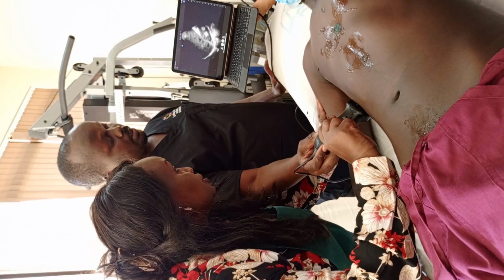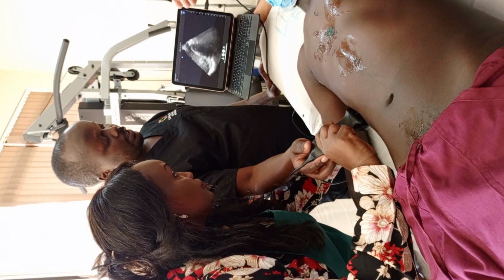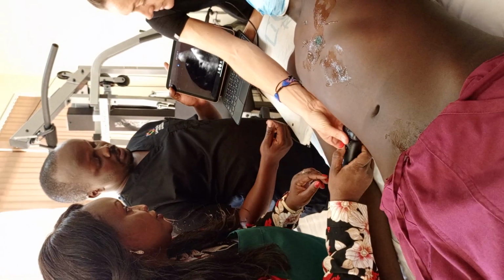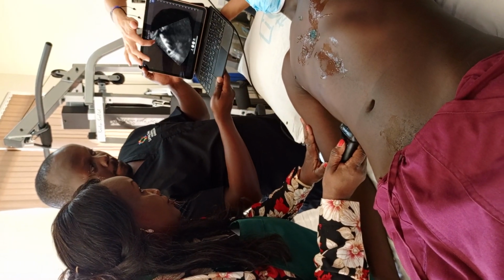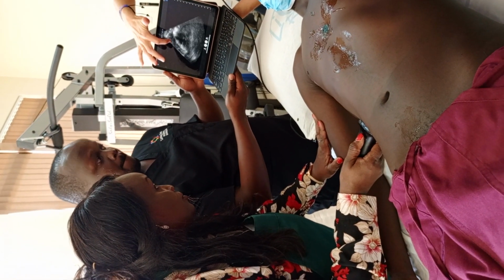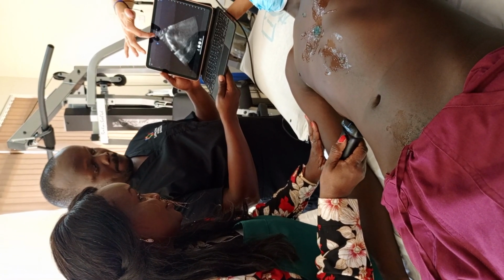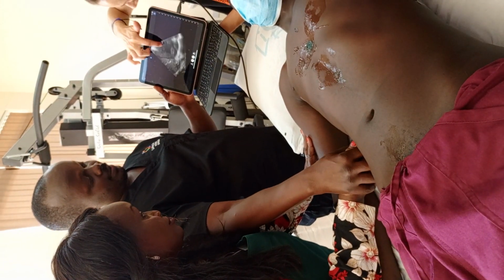So this was a pediatric patient. This was a 6-year-old. Oops, sorry. You can also just go down. So we're seeing liver. Now we just need to find it. I promise you have both kidneys, right? No, we already saw it. I know you have both kidneys. Oh, it's coming right there.